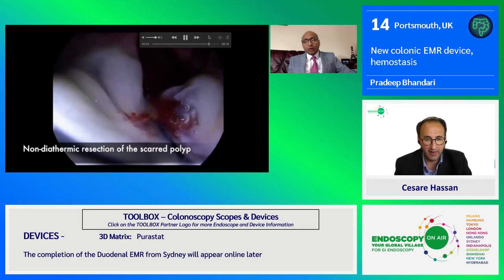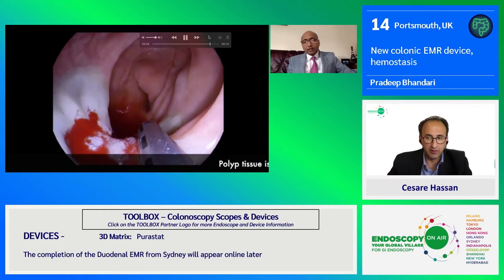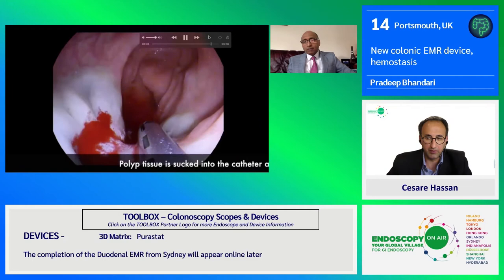Already in one sweep, we managed to remove most of that adenoma. Now we'll go a little bit forward and backward with it to take the scar tissue and any residual adenoma.